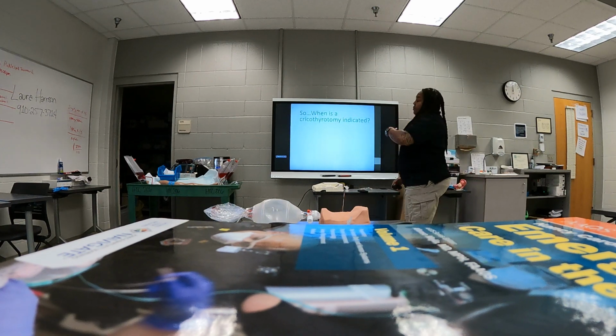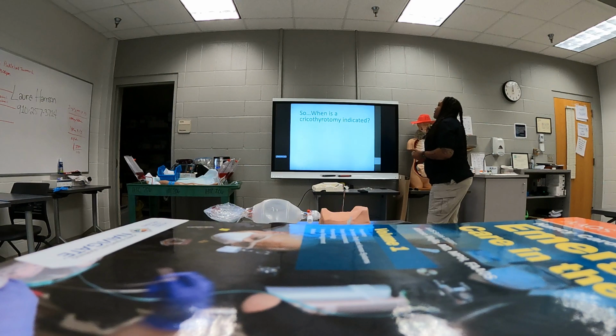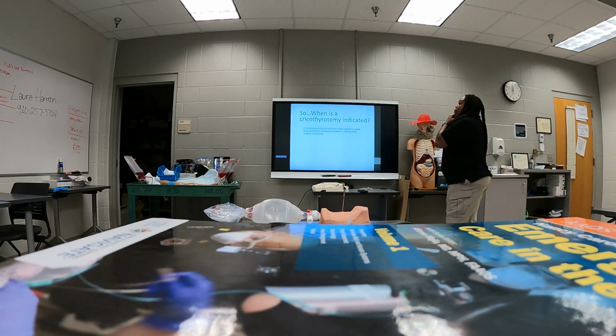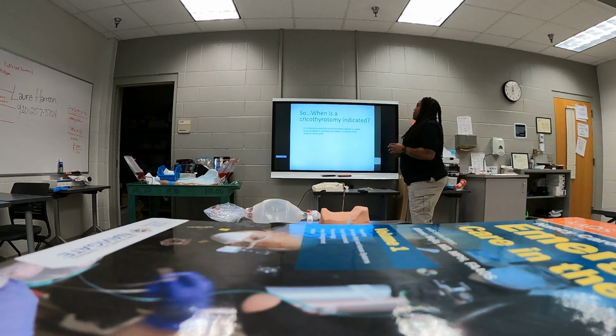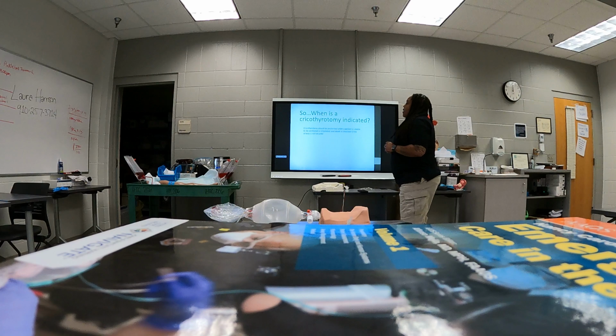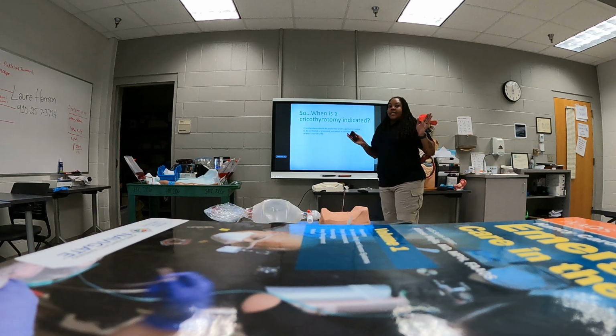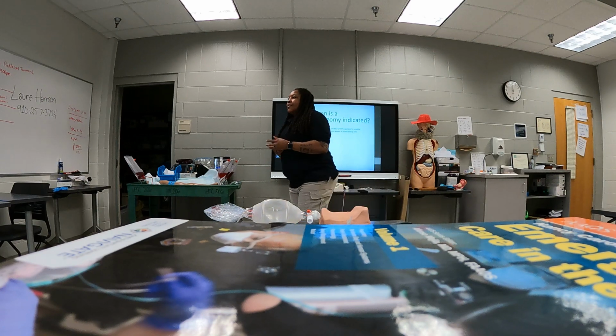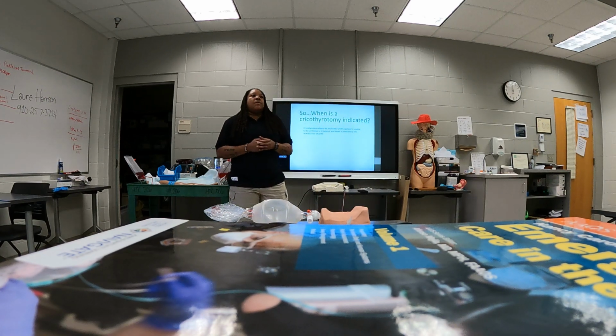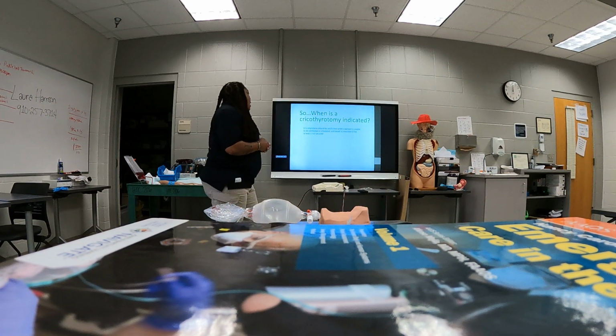So, this is what we were just talking about. When is a cricothyrotomy indicated? Cricothyrotomy should be performed when a patient is unable to be ventilated, intubated, and death is imminent if the airway is not secure. So like I said, that is your feng shui, and that's your MO. That's what you're supposed to be doing, is managing their airway. Okay. So.